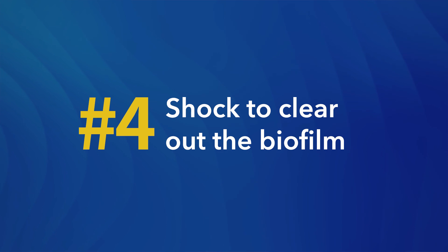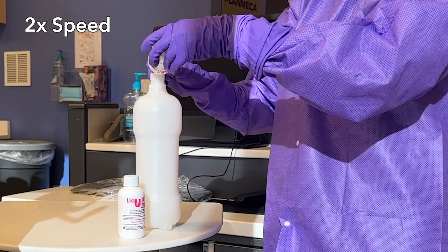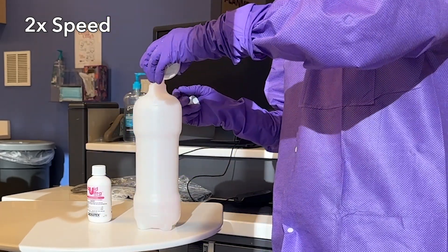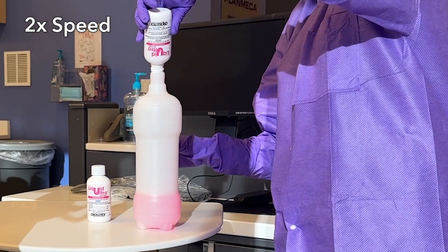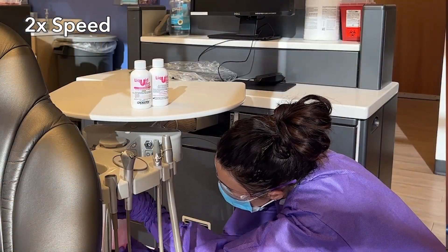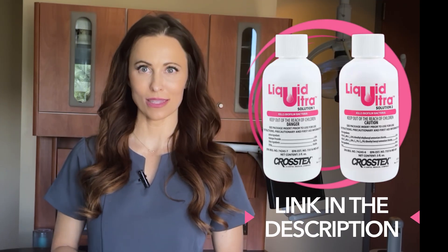Tip number four: shock to clear out the biofilm. Over time, even with regular testing and treatment, biofilm can build up in the water lines, creating a persistent source of contamination. This is where shocking comes into play. Shocking your water lines is a more intensive cleaning process designed to remove stubborn biofilm that standard treatments may not eliminate. I recommend using water line specific shock treatment products like Liquid Ultra by Crosstex.